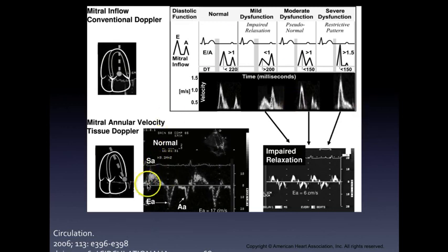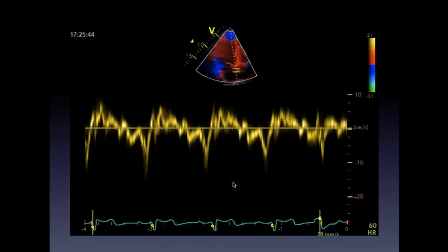What we do is we have the tissue Doppler area of interest placed on either the lateral or the medial annulus. And we're looking at the excursion of the mitral annulus in systole. There are normative values produced for systolic excursion. It's useful numbers. On average, healthy young people will have velocities of maybe 12 centimeters per second. Once you start getting below 10, you begin to question dysfunction. And if it's, say, 4, 5, or 6, you can pretty reliably say that systolic function is reduced. It isn't useful in every case, but I will show you an example later where it did prove useful.